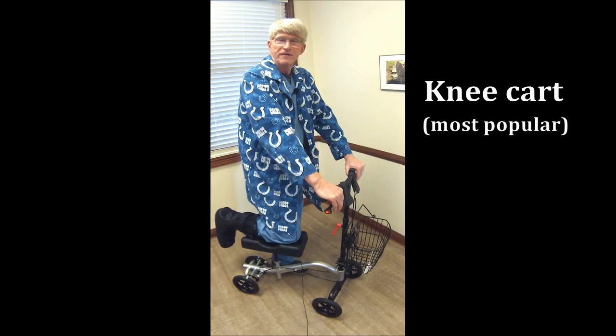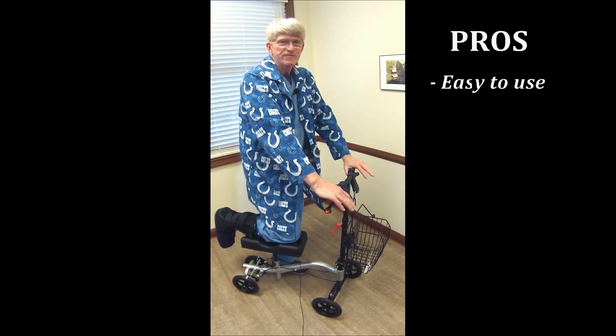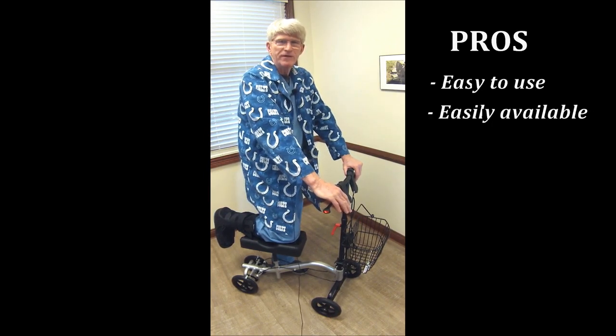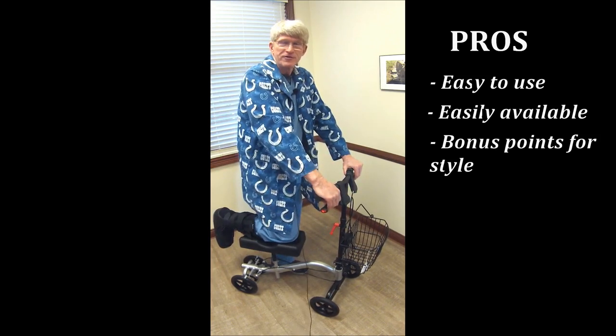Now, this is the knee cart — knee stroller, kneely cart — and they're pretty popular now. You see an awful lot of them around. The nice advantage of this is that the learning curve is very quick and pretty easy. They're available in many, many locations. You can bling these out with a cart horn, which is also nice to do — you get bonus points for stylizing these.